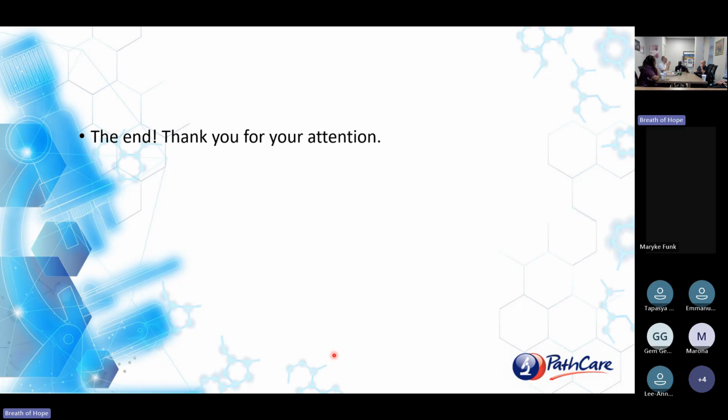Well, the TEG, where the evidence supports TEG, the reason we managed to get the TEG 6 approved by the medical aids is that it guides blood product usage. It's not been validated for diagnosis of DIC. The ISTH DIC score has been validated for the diagnosis of DIC. If you decide now you need to give blood products to this DIC patient, or there's a clinical problem you want to solve, this patient's bleeding, or you want to give a blood product to control the bleeding, that's where TEG would guide you as to what is the most appropriate product. Should you give fibrinogen, plasma, or platelets?